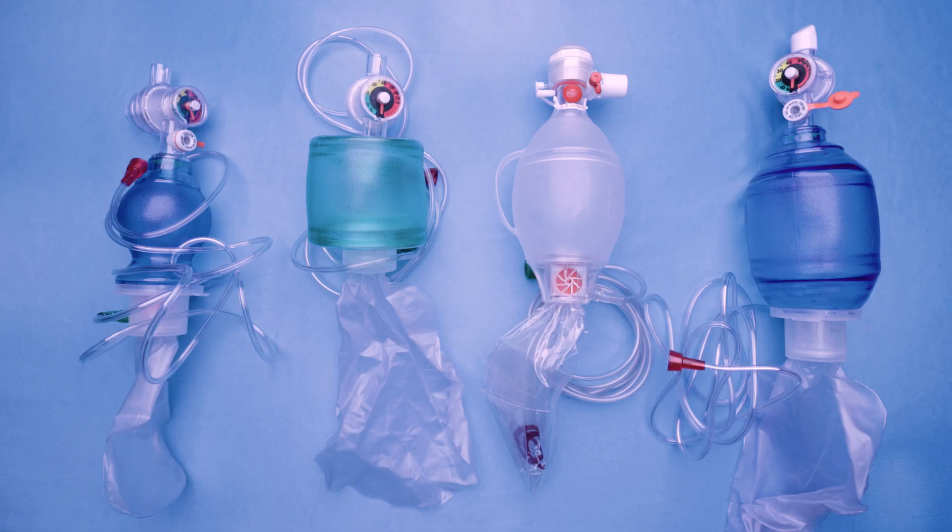You may also hear the self-inflating bag called an Ambu bag, which is the brand name of a commonly used resuscitation bag. You may receive another brand at home that could look slightly different, but all the parts will be the same.